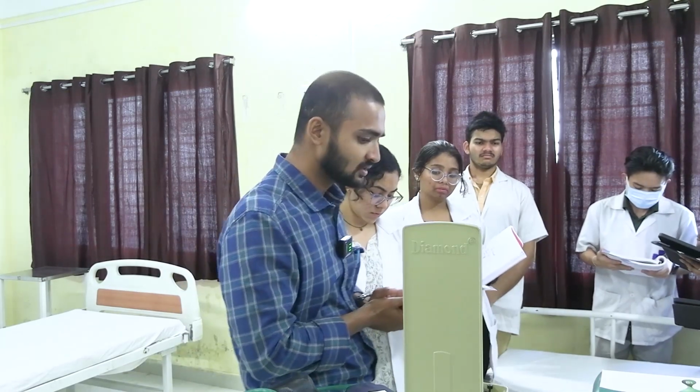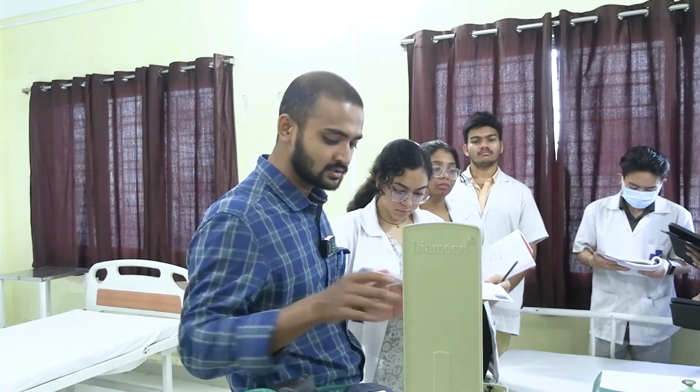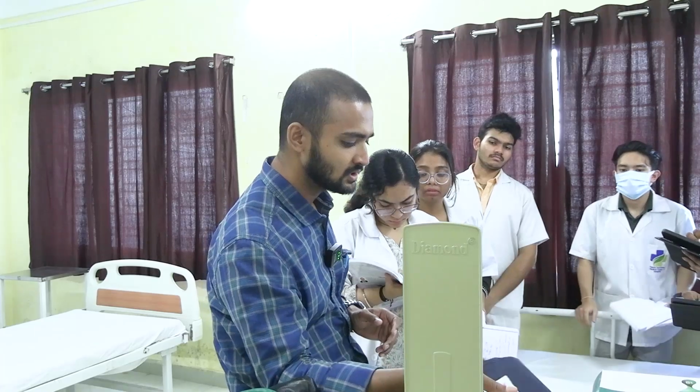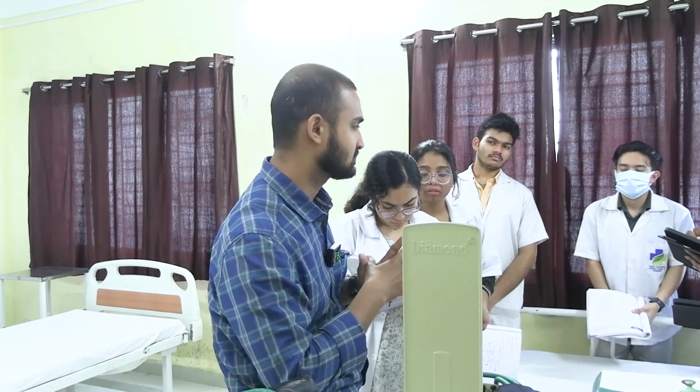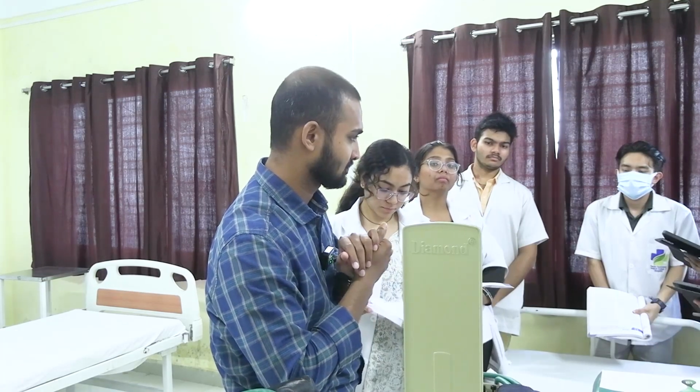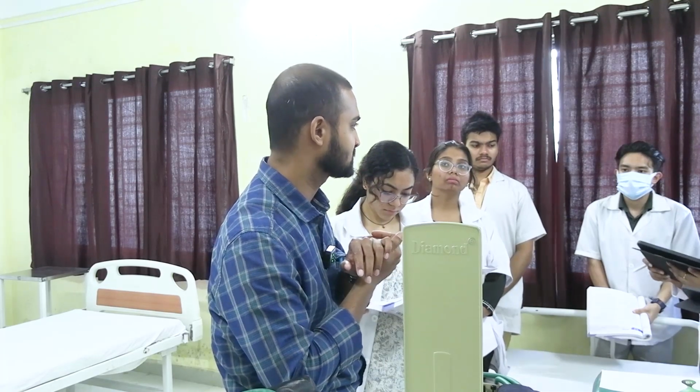So you know now the parts. So you should know also the criteria or the procedures how to measure a BP. So how will you measure a BP? Have you ever measured? Have you ever seen someone? Okay, how?